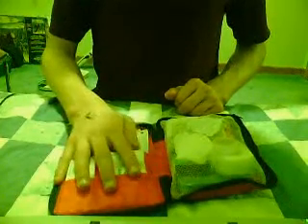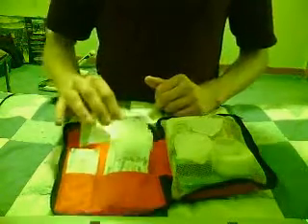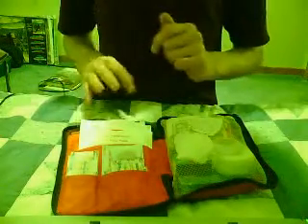I really should have some in this section just poking out for quick use, and this is for quick use as well. In an emergency situation, this side's really good, because if I lay my hand on it, I can get one or two things. I can get the adhesive pad real quickly, I can get the gauze pad fairly quickly, I can get this fairly quickly, and the band-aids especially quickly because they're first up. Just a really quick first aid kit. It's like, get it done, get blood stopped, keep moving type of thing. That's why it's kind of good for in a survival kit or just carrying with you, for that matter of fact. Now we're going to be talking about this side.